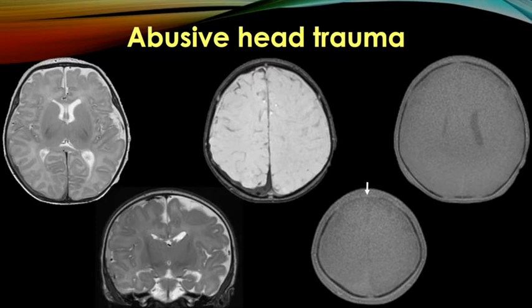Well, as we've seen previously, there's a spatial resolution limitation. So it's possible that you might miss non-displaced fractures or microfractures. In essence, you have a false negative. However, you could also argue that if you don't have any parenchymal sequelae from those fractures, does it actually matter?